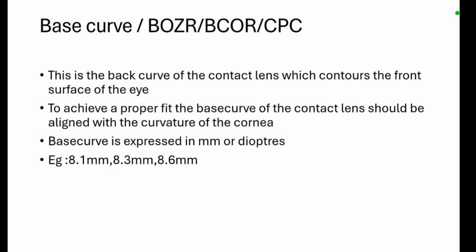So a proper fit means correct fit. It is not too tight or too loose. Okay, that is the proper fit. So in order to achieve that, we have to align the base curve with the curvature of the cornea.